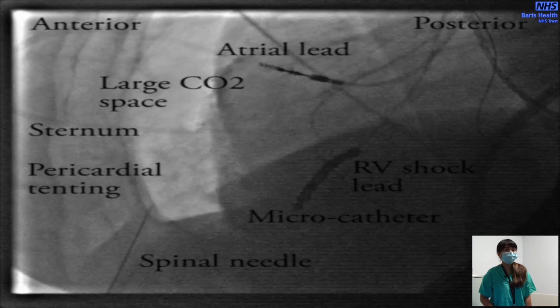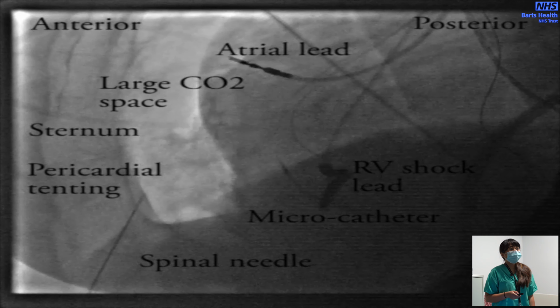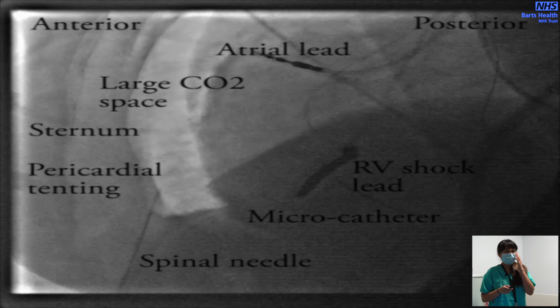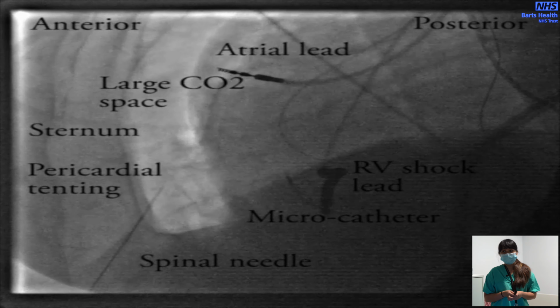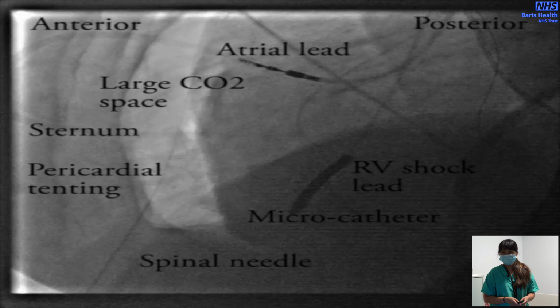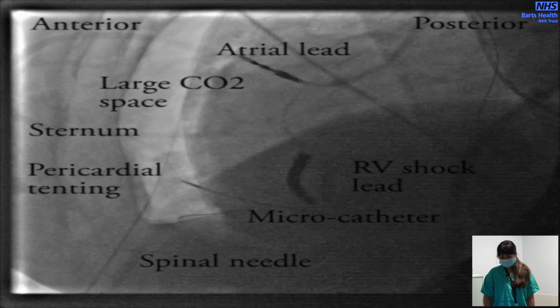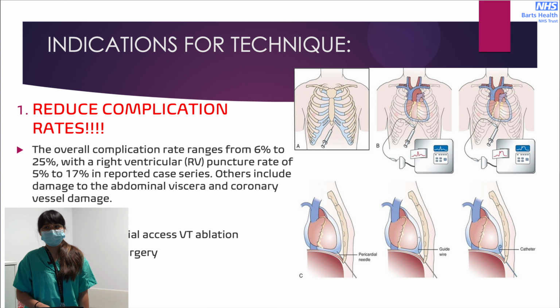Could you now tell me, under contrast, are they using carbon dioxide instead of contrast? No, only carbon dioxide, because contrast will just leak through the needle. Sometimes they use contrast if they're not using the CO2. Contrast is mainly just to confirm their position, but not for the puncture.